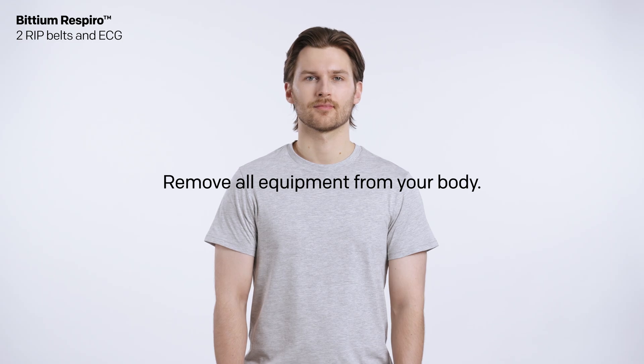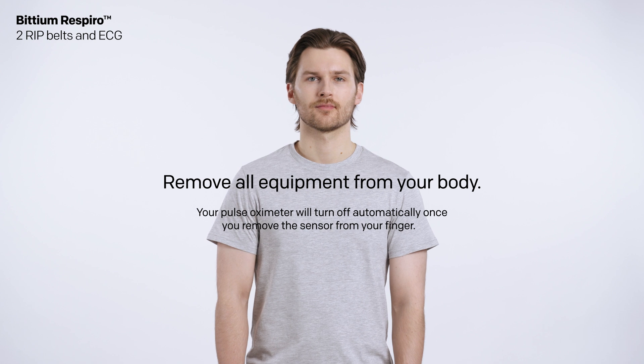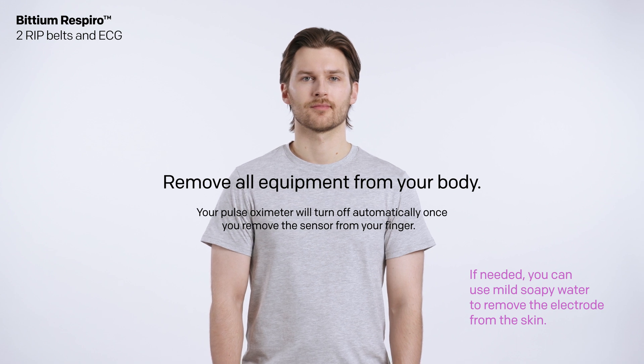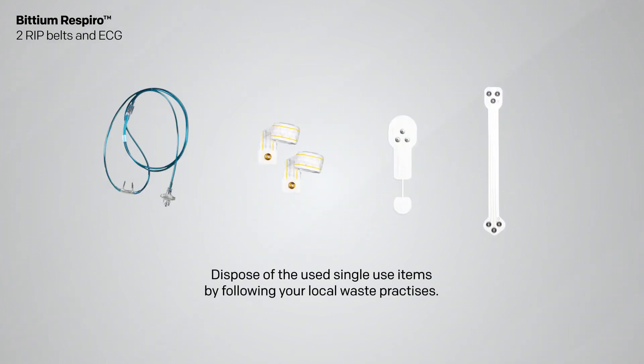Remove all equipment from your body. Your pulse oximeter will turn off automatically once you remove the sensor from your finger. If needed, you can use mild soapy water to remove the electrode from the skin. After the measurement is completed, return the equipment to your clinic. Dispose of the used single-use items by following your local waste practices.